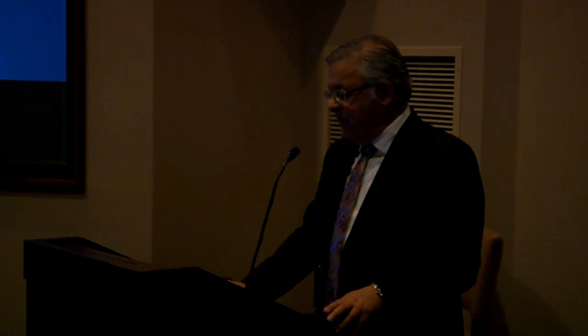With tissue necrosis, I think it's kind of intuitive. You have cell death, you have breakdown of microcirculation, you have breakdown of cell membranes, you have release of intracellular water, and that will change the diffusion characteristics of tissue. And these things can be clinically significant. How much movement, how much diffusion is really going on? I'll just show you this.